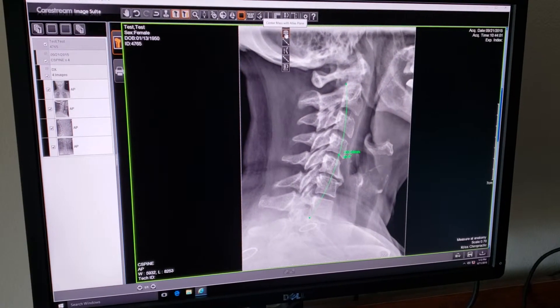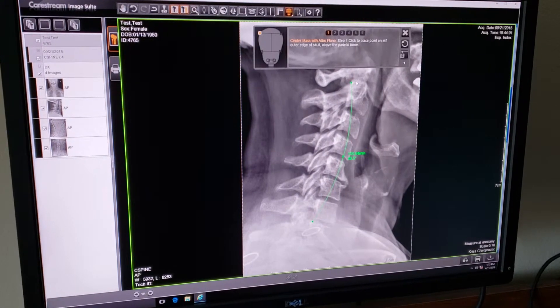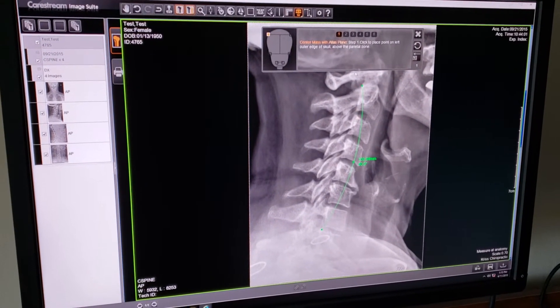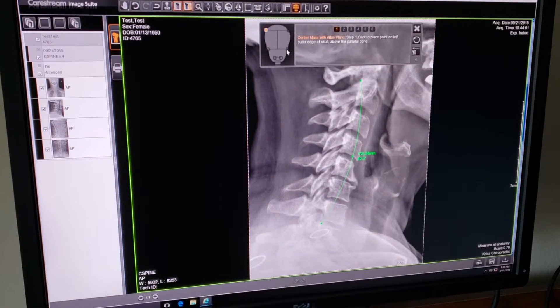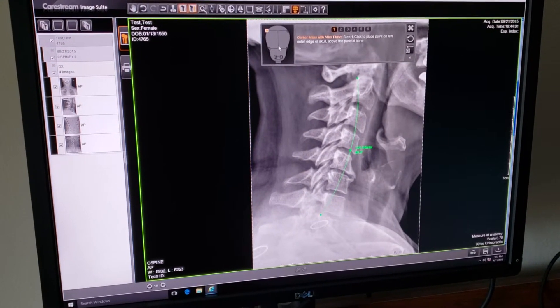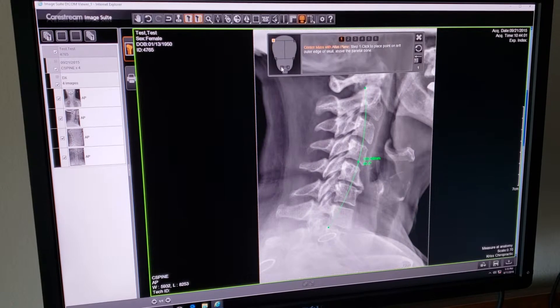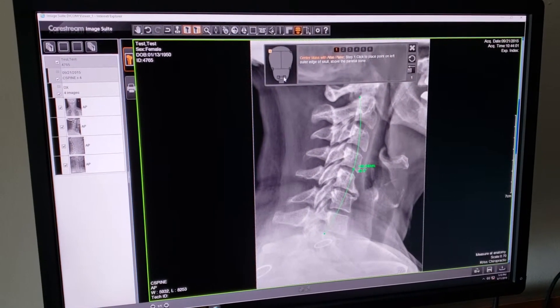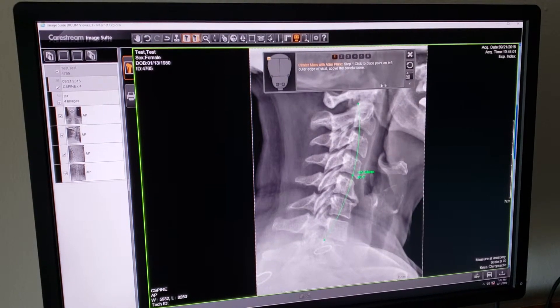The next tool is center mass with atlas plane line. I do not have a really good example image for it, but basically it will have you plot the four corners of the skull and create the gravity center skull line. Your next two points will be the corners of C1, and it will give you an angle of C1 from the center line of the skull.